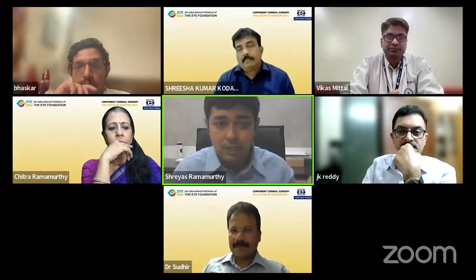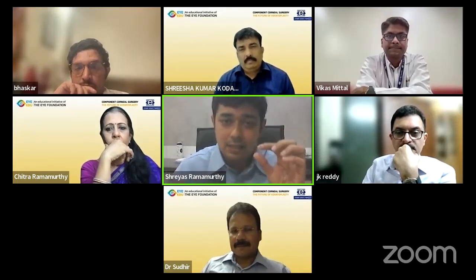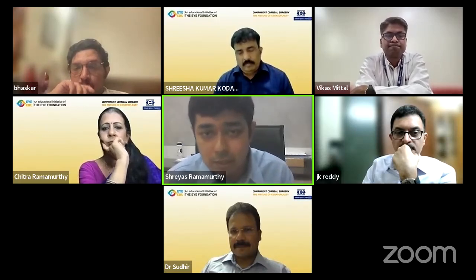If we have a uniform 30 micron, uniform 50 micron, uniform 60 micron, I think the visual impact is going to be less. Especially with keratoconus, where the majority of our cases are keratoconus, having a very thin cornea in the center and a relatively thicker mid-periphery, how do you ensure that you are able to get a very uniform stromal bed like you are showing in many of your cases?